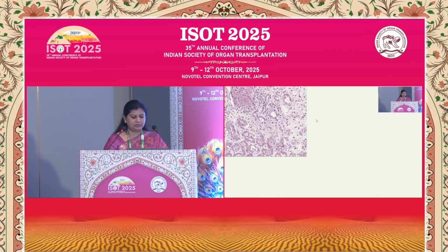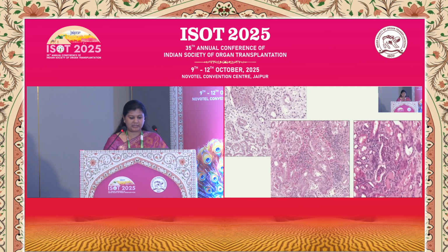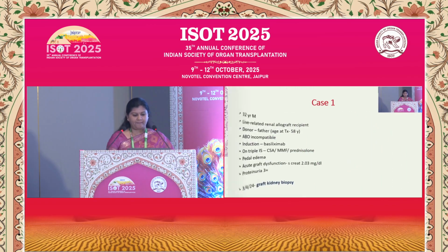Then the other findings which we can get are glomerular or tubular necrosis. And again, we can have interstitial hemorrhage. And this is a characteristic finding that at times we can get a collection of neutrophils in the lumen, not of the PTC, as I've already told, but this collection of neutrophils we get in the tubules. So here, in this image, we can confuse such a scenario with that of acute pyelonephritis because neutrophils are present in the tubules.